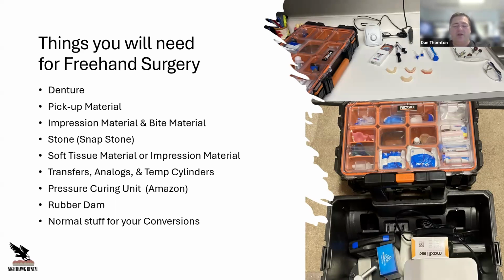In the fast set, it normally sets up about 3 to 4 minutes. It's a lot better than some of the other ones. It takes a little bit around 7 minutes to set up. Definitely dispense a little bit out of your tip before you actually put it into your temp, just for the fact that sometimes the beginning of it doesn't mix very well. So at least get some of that out of your tip before you go ahead and set it up.